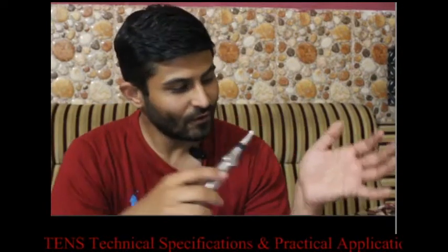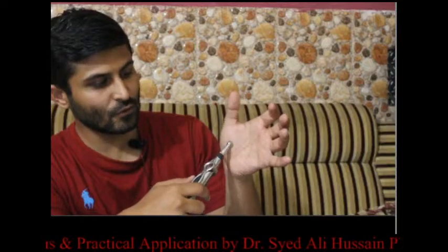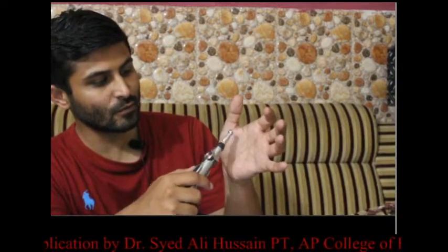So as soon as I place it, you can see the point where I get the most response. This is the point where I'm getting the most response. Over here there is very little response, over here very little response, over here no response, there is some bit of response, and even the response is on the finger and the thumb.